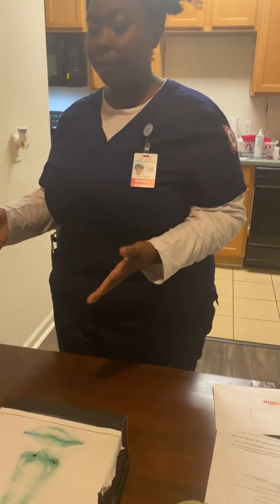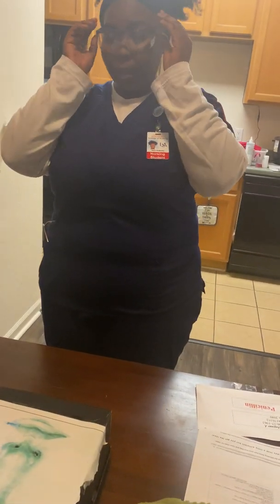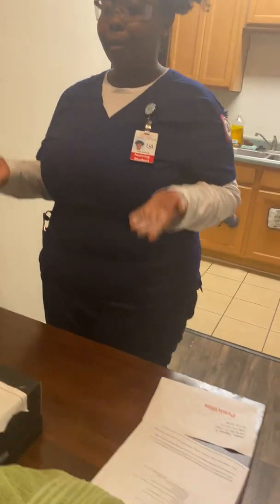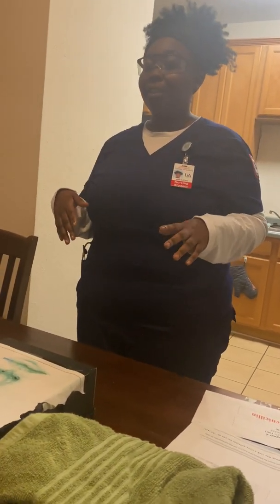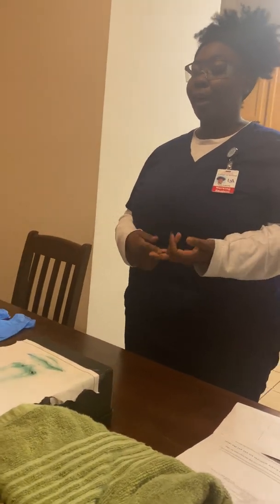So next, I'm going to gather my materials, and then I'm going to don my goggles. Then next, I'm going to position my patient to a workable height. I'm going to put them in high Fowler's position, workable height, and lower the bed rails. Then I'm going to begin auscultating for bowel sounds, and assess their oxygen saturation and vital signs.